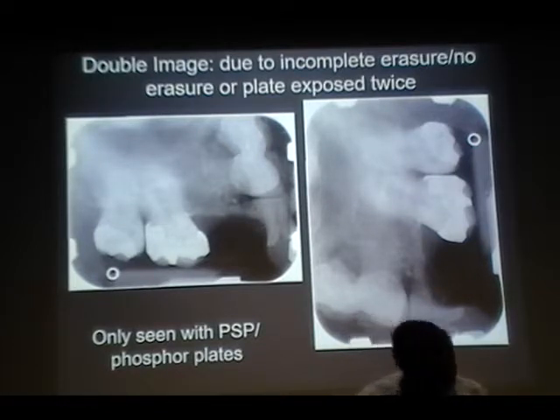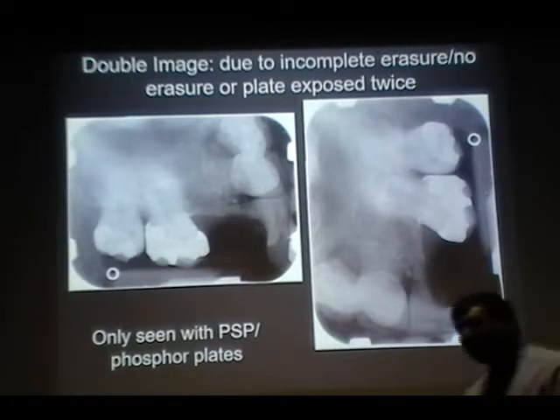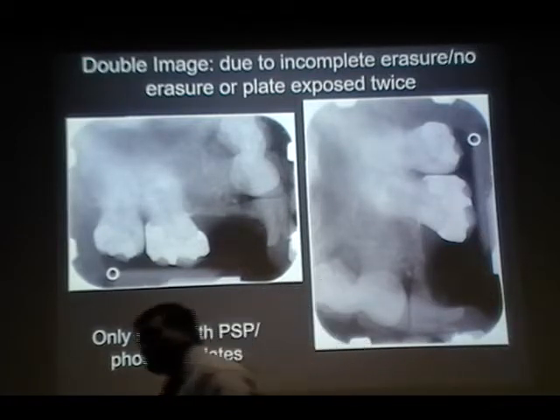So now, if you're using PSP plates in the practice that you are going to go to, please make sure that the scanner will erase the image before you capture.